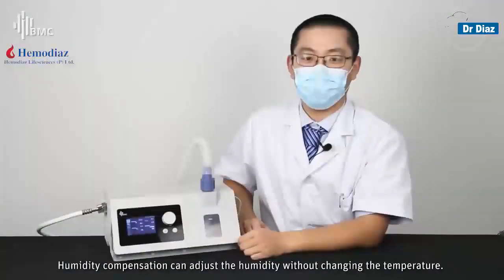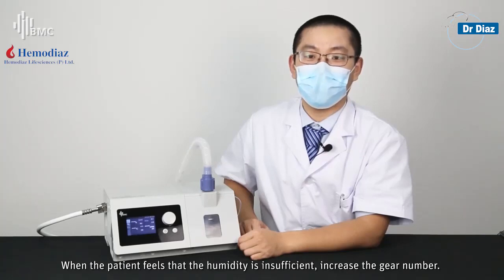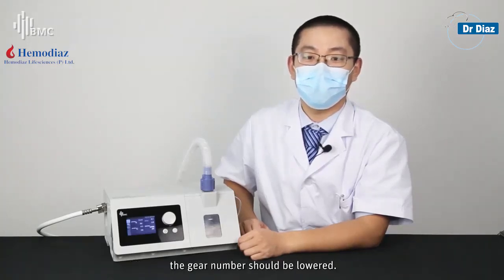Humidity compensation can adjust the humidity without changing the temperature. When the patient feels that the humidity is insufficient, increase the gear number. When the humidity is too high or there is more condensation in the heated tubing, the gear number should be lowered.